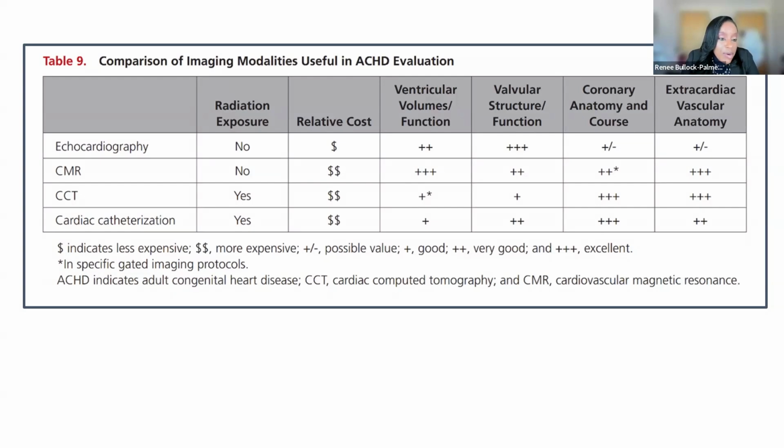Both CT and CMR are costly, so there are some institutions that may not have all of these modalities, that they may have to refer outside to have this study done. And it's not just having the study or having the nice camera there and all the technology, but do you have someone that can interpret these studies? Because I can tell you, looking at these studies, it takes time, and sometimes you have to go back and look at that surgical report or that prior study to really see if what you think you're seeing is real or not.